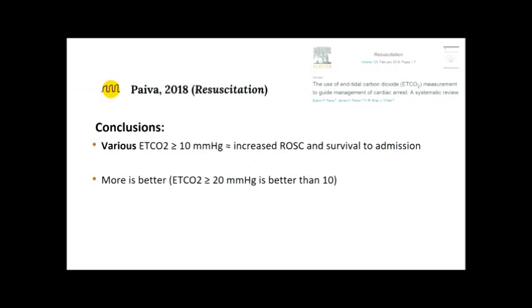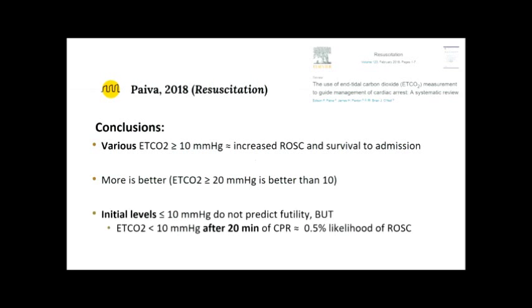With respect to our initial levels, an initial level less than 10 doesn't predict futility. So I'm not trying to say that if you get that patient, you put an end-tidal on, and it's 8, that we call this as a futile resuscitation. There was a study, that we could chat about afterwards, that looked at this, and there were survivors with initial levels less than 10.